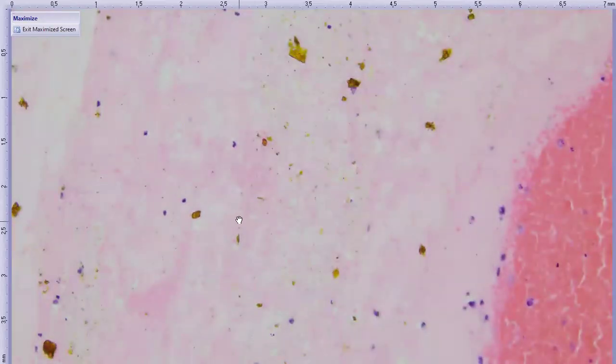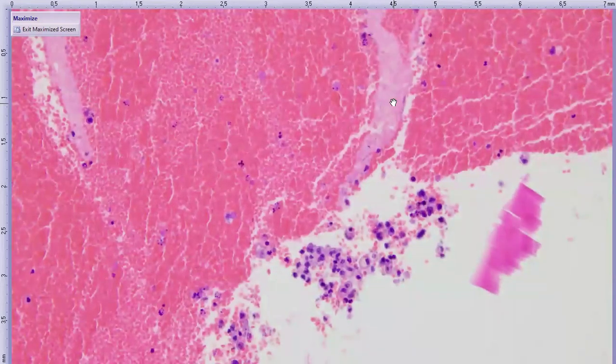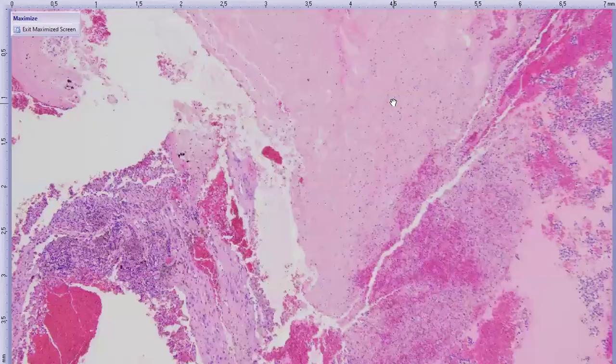As we move posteriorly, we have some eosinophilic material, and there's a bunch of this golden brown stuff around, which is probably hematoidin crystals. And that's a good indication that this has been a very chronic process. From the history, we knew it was at least a month, possibly longer, since this dog started bleeding into its eye. So we're just going to continue to move posteriorly.